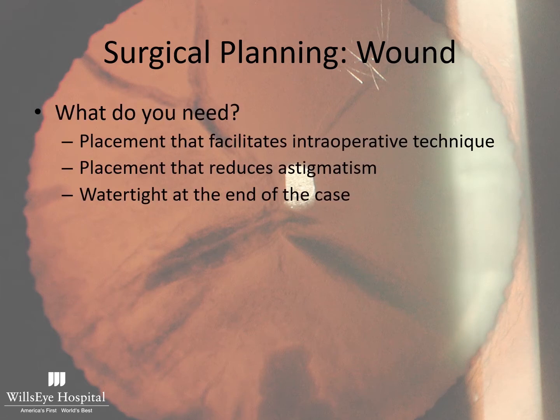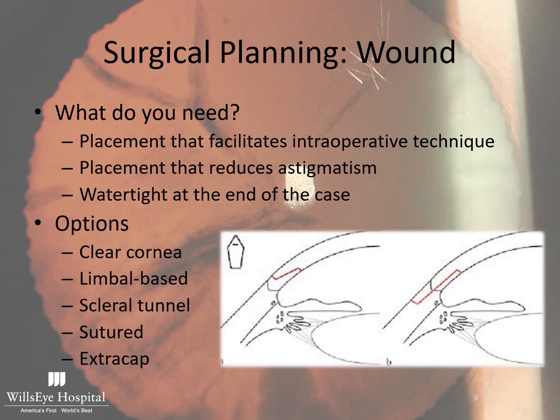Wound placement. What do you need? You need placement that facilitates intraoperative technique, reduces astigmatism, and is watertight at the end of the case. In general, we're going for a self-sealing wound.